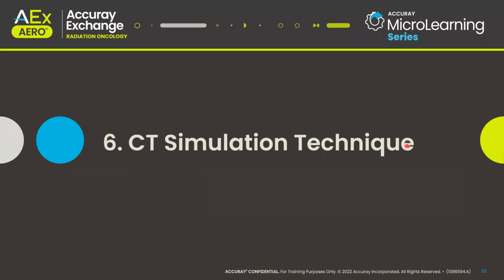Finally, let's spend some time talking about CT simulation technique. We've talked in depth about the importance of providing the algorithm with a high quality image, but equally important is providing the system with a high quality DRR to compare that live image to.